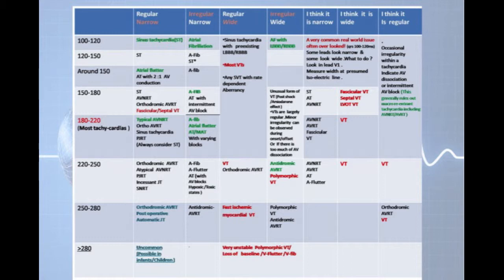That's shown in green. Number two, it gives you an assumption of types of tachyarrhythmias, the rate, and what types of rhythms they actually are. For example, is it sinus, or is it a reentry in nature, as seen in the I think boxes. And thirdly, it shows the rates above 190 are more than likely ventricular in origin, shown in red.